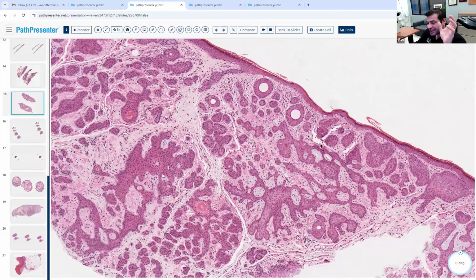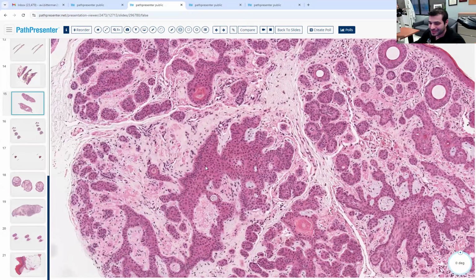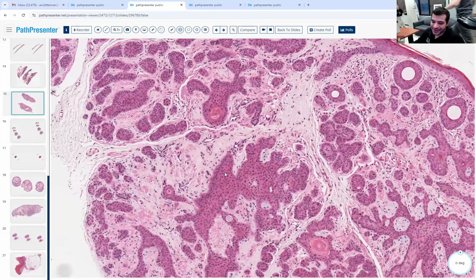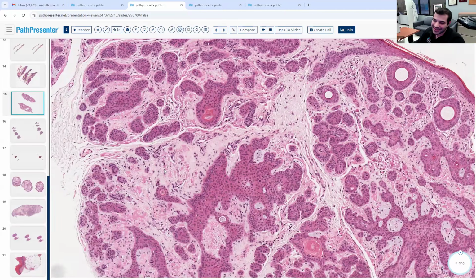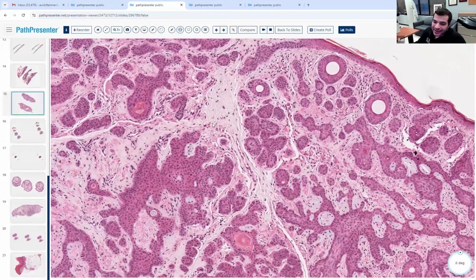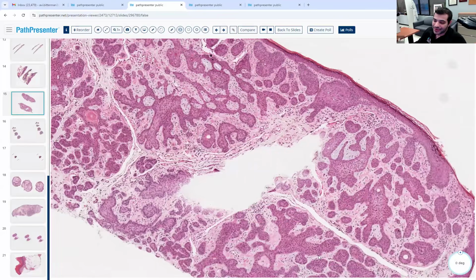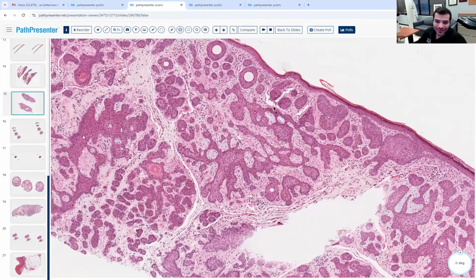So you want to have a yield sign up. You want to be like, okay, well, it could be a type of basal, but with adnexals, let me just pump the brakes just a bit. I'll take a look at the adnexal neoplasm. Does the stroma really match for basal? Is it retracting like a basal would? Is it palisading like a basal would? And in this case, the answer to those questions is really no, no, and no. And so this is really a hamartoma. Now there's some debate about whether we should call these hamartomas or basaloid follicular adenomas, but you're not responsible for that.